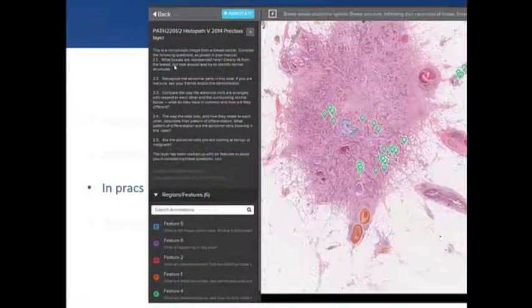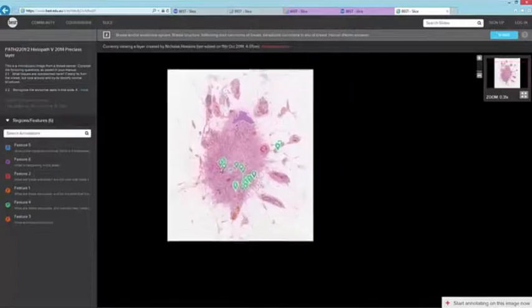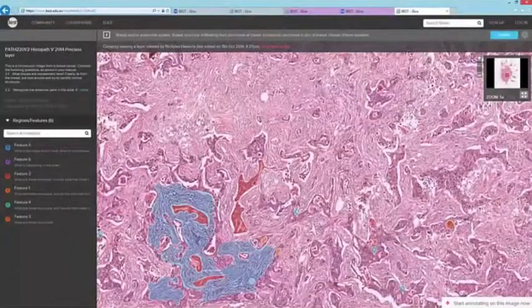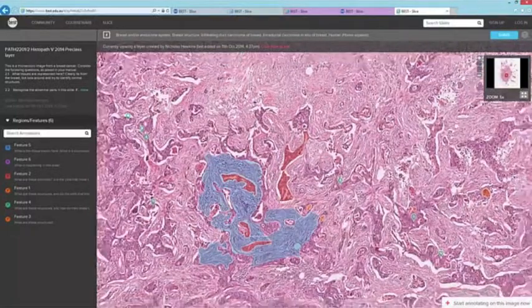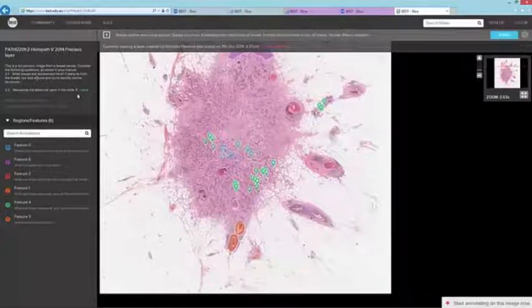this is one approach. We just saw this image before. I said I'll show it to you in the lecture, and what I've done now is I've copied that image from the lecture. I'll just click on this so we can see it actually live. There we are. And you can see it still contains those areas that I marked before for the lecture, but I've added a whole lot more stuff. And this is a pre-class layer, and so students get access to this.